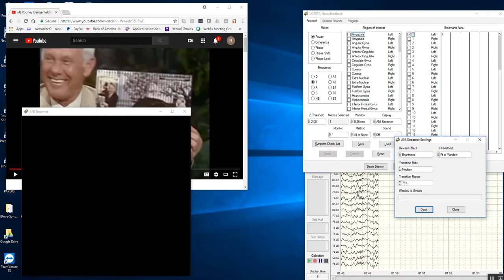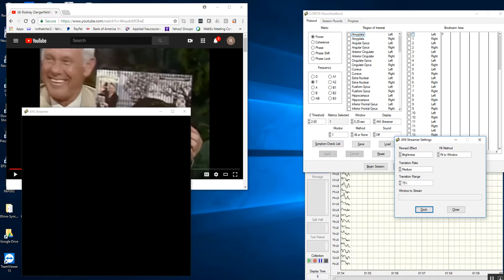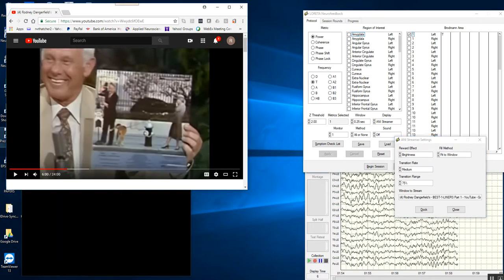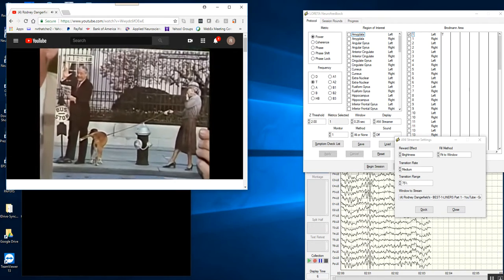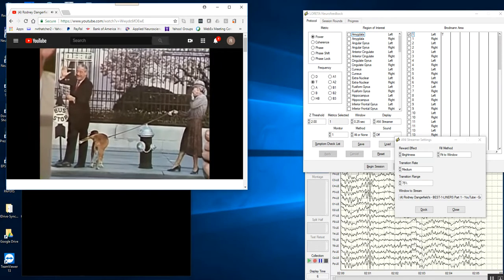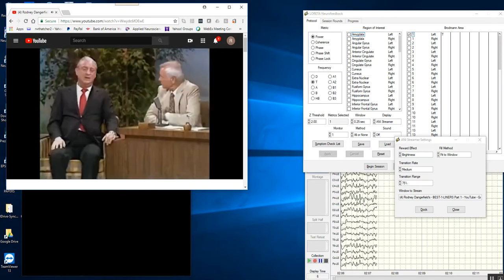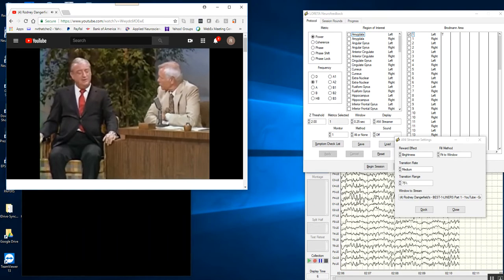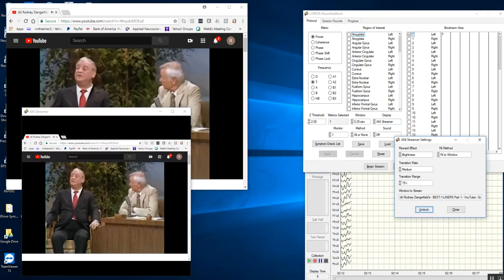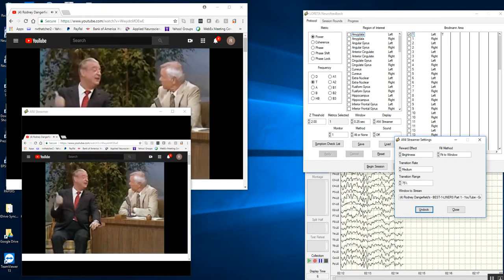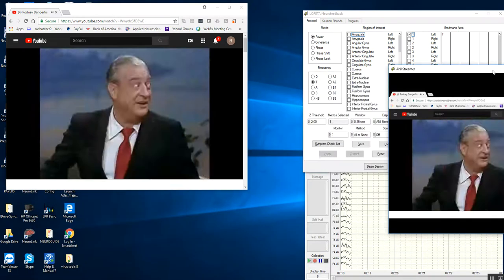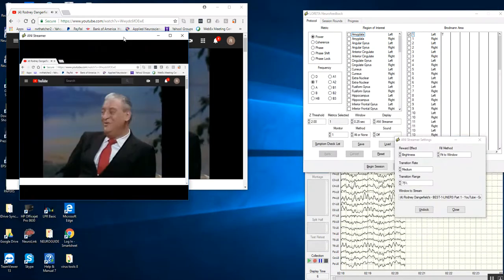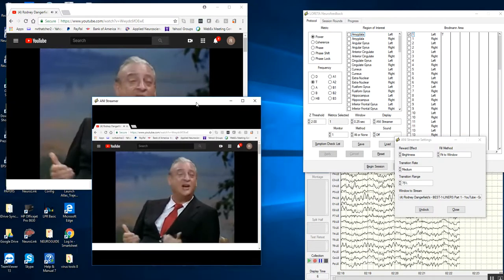The first thing you want to do, I have a YouTube here. I could have anything—it could be Netflix, you name it—but you want to just simply click on that. I'm going to start it going. You can see in here what you selected. This happened to be Rodney Dangerfield Best Liners, and now I'm going to dock it in the display that will be placed on the subject's monitor. This is the docker itself. This is what we will move to the subject's monitor to do biofeedback.